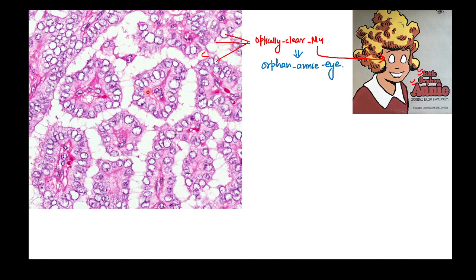And in between you can notice these are the fibrovascular core. Can you see this? There is a blood vessel, right? Fibrovascular core is very clearly visible, right? So I'm just pointing here. This is the fibrovascular core which is forming the true papilla, right? In true papilla we need not write true papilla, just papilla means true papilla. Whenever there is no vascular tissue in between the fibrous tissue, then we will be calling them a pseudopapilla, right?